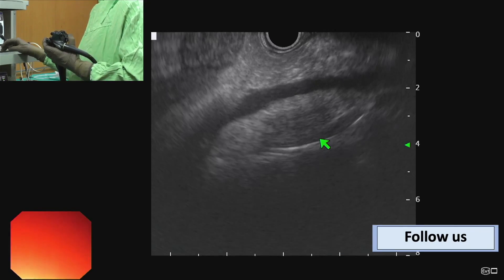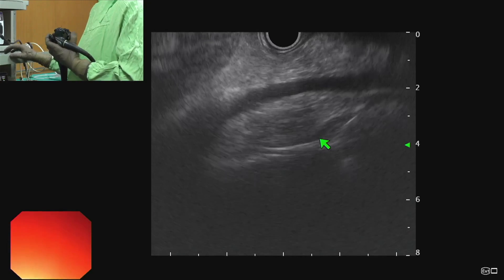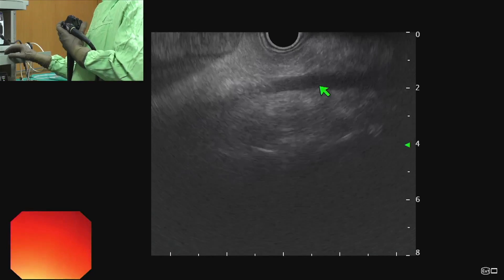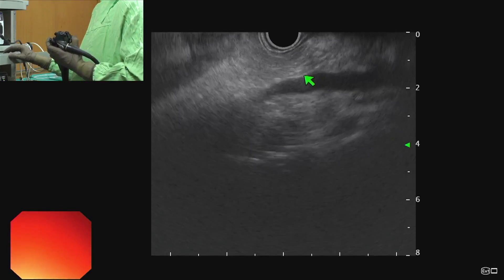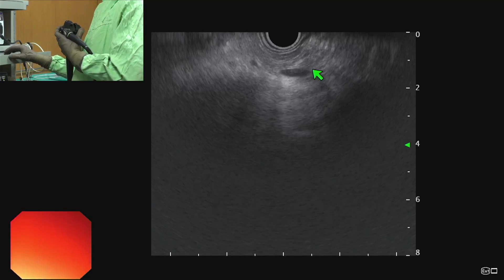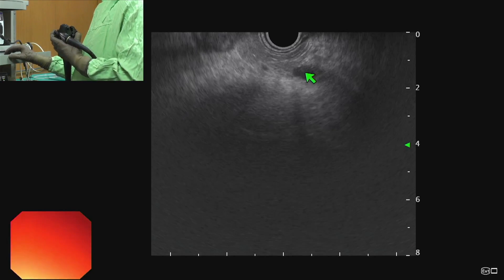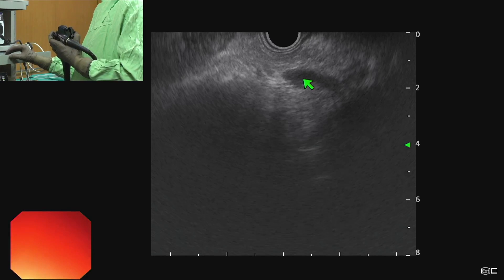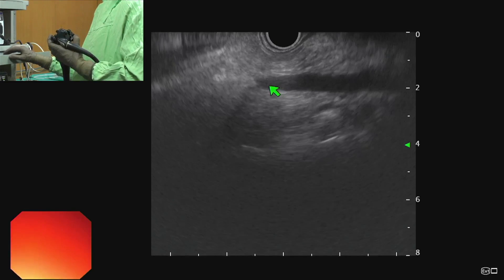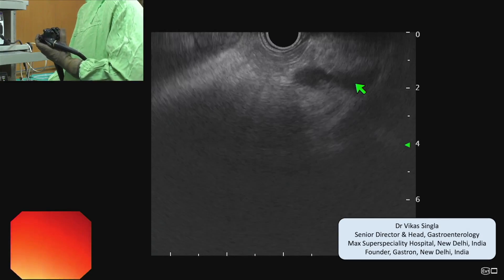For evaluation from the proximal stomach, we first localize the junction of the SMV and portal vein. Here we can see a linear vessel structure which is the SMV and portal vein, and from here we can see that the splenic vein is joining with the SMV coming from the left side, and after the union of the SMV and splenic vein we can see the portal vein on the right side.